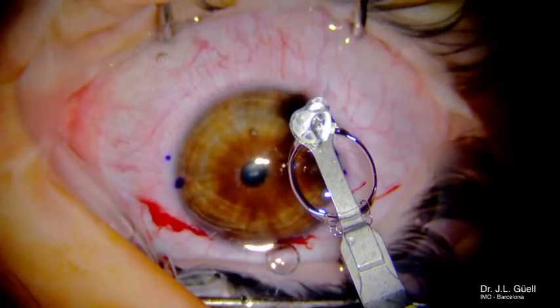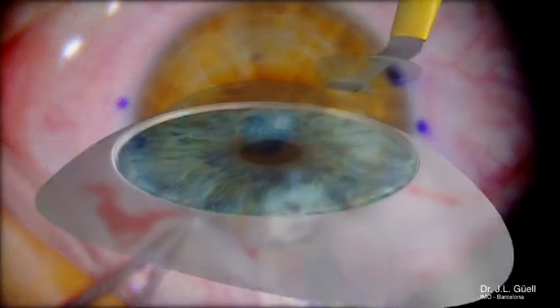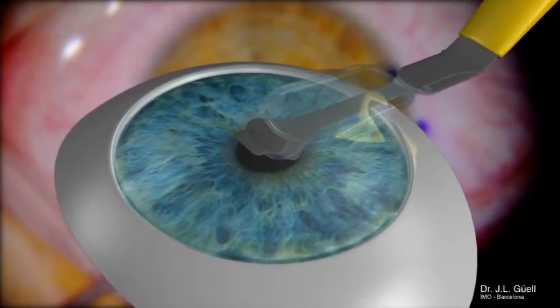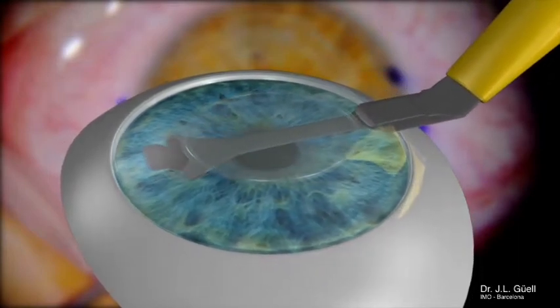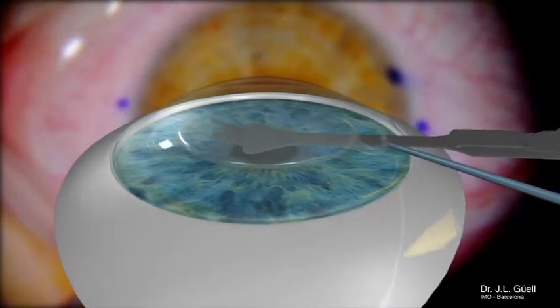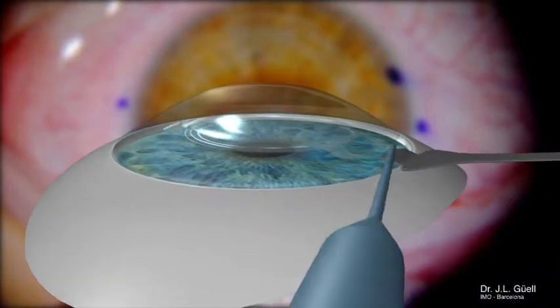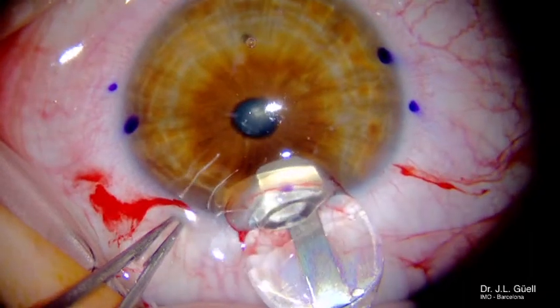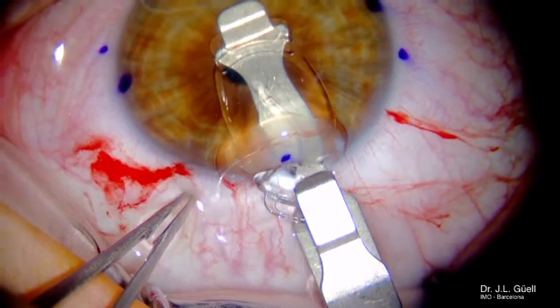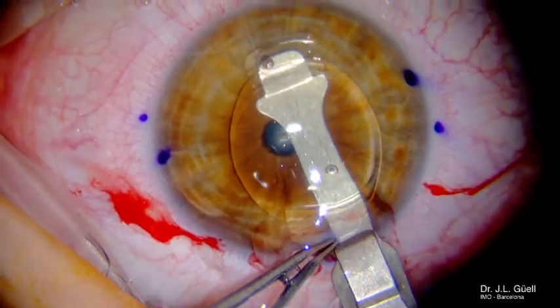In order to protect the entrance, we put some more viscoelastic on the frontal tip of the IOL, and then we gently introduce the lens through this incision. As you can see in this diagram, the lens is squeezed through the incision, and we like to do it in just one maneuver until the complete optic is inside the eye.